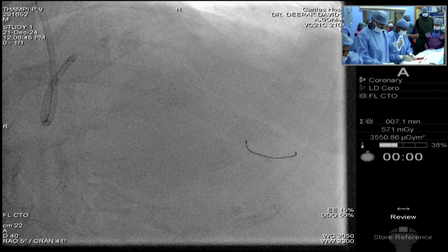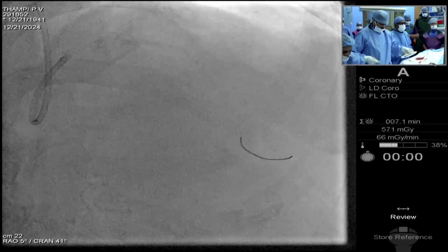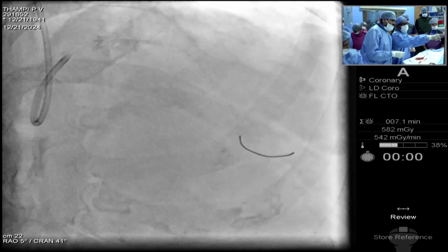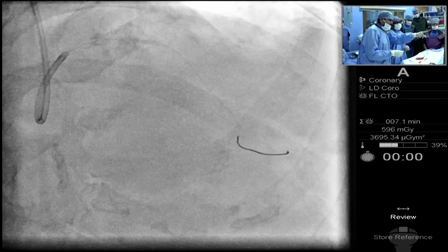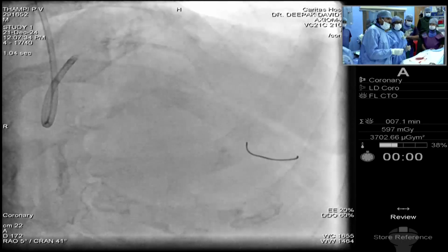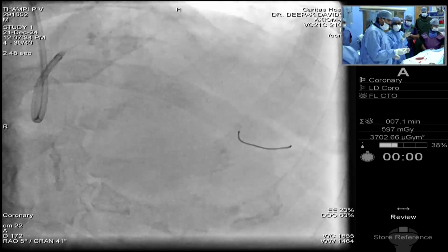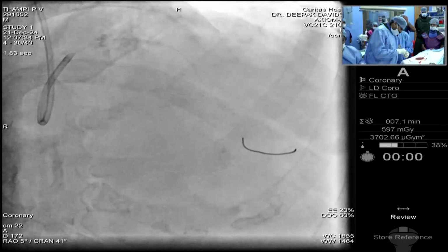Okay, the device. Sini, we'll concentrate on that calcified area. The wire hugging calcium we are seeing there, that is the area where we didn't go across with the OCT catheter. So that area we'll concentrate on. Yeah, near the bend. That's it.